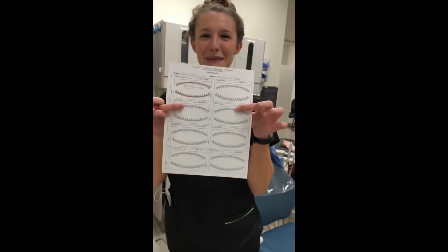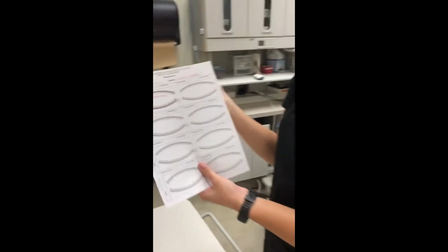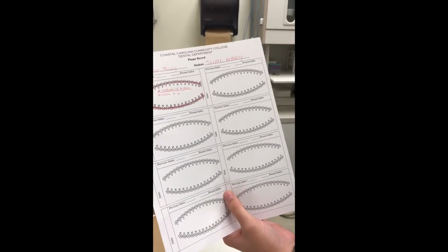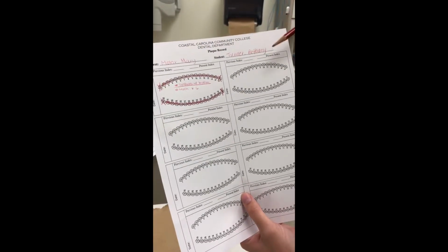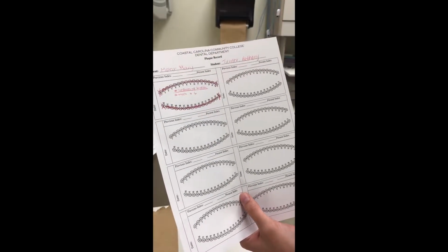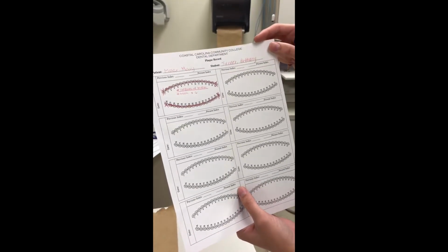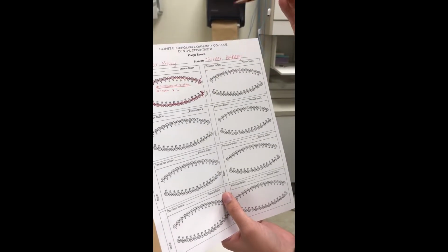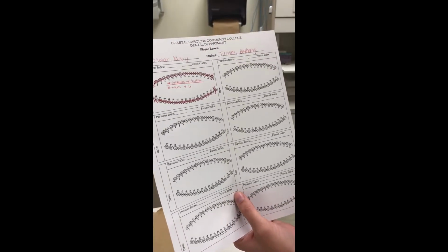Okay. So, this is what a plaque index form looks like. And this is so we can see, first of all, how much plaque our patient has on their teeth. And it's also to compare to the next appointment when they come in. Because if their plaque index is the same, then maybe you missed something when you were going over oral hygiene instructions with them. Or maybe their dexterity's bad, but whenever your patient comes back, they should not have a higher plaque index, and you want it to be lower than it was at the first appointment.